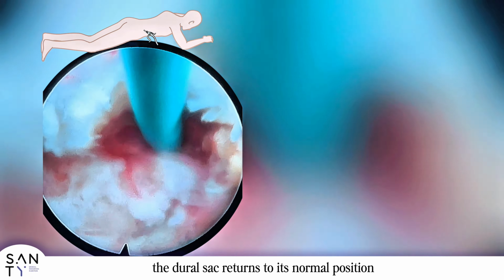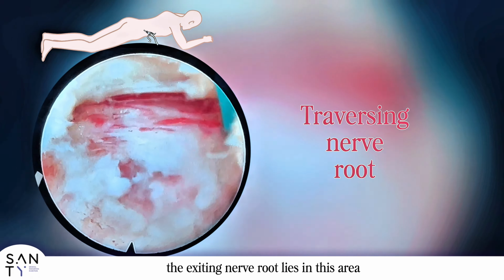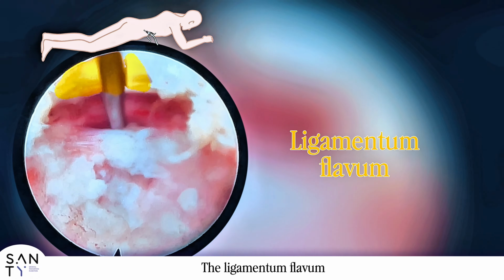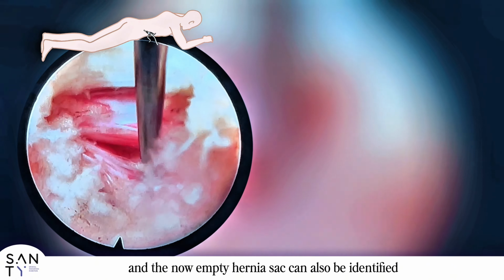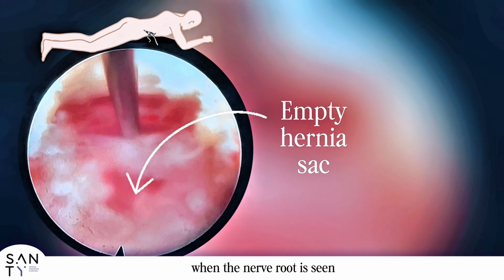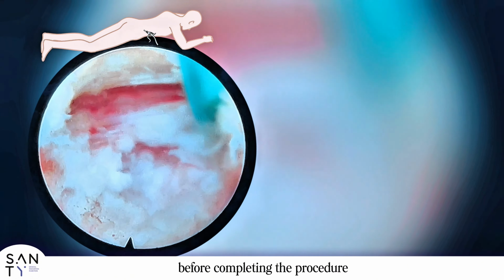After removal, the dural sac returns to its normal position and the traversing nerve root becomes visible. The exiting nerve root lies in this area. The ligamentum flavum, the posterior longitudinal ligament, and the now empty hernia sac can also be identified. Adequate decompression is confirmed when the nerve root is seen to pulsate. Careful hemostasis is required before completing the procedure.